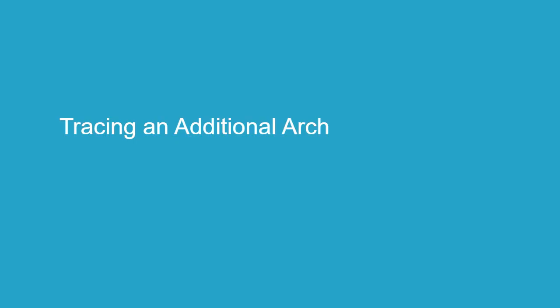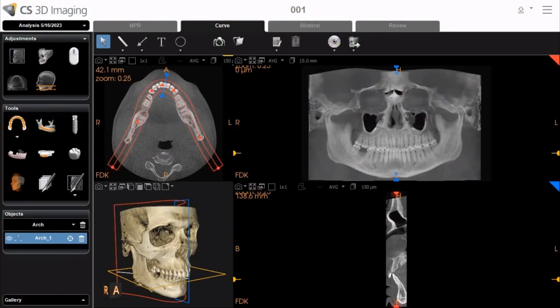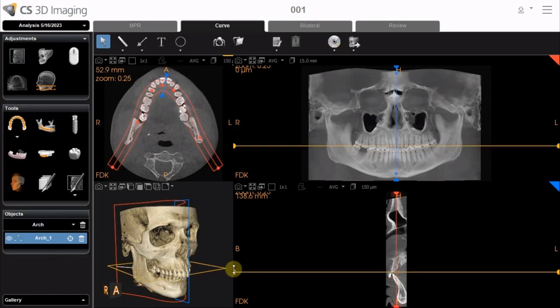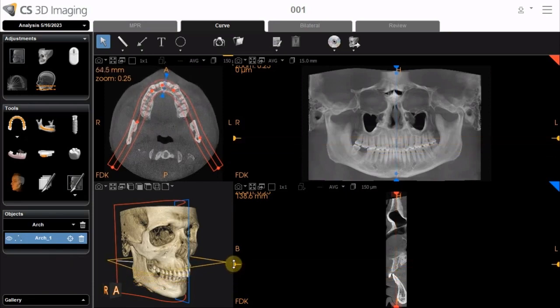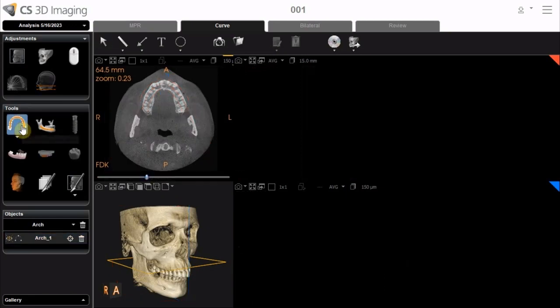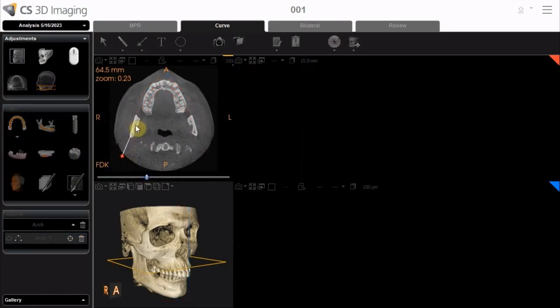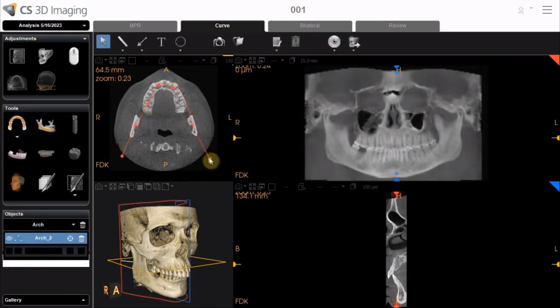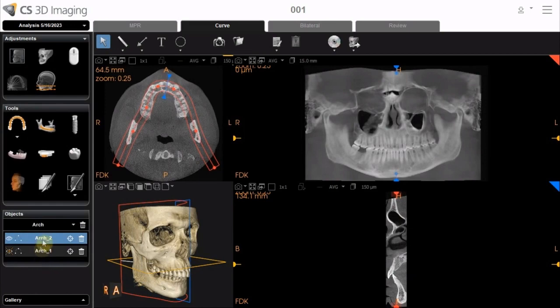Tracing an Additional Arch. The capability to trace two jaw arches is now available. As demonstrated, trace the first arch. In the Object List, double-click inside the toolbar to name it. Move the axial plane to the second arch position, activate the Manual Tracing tool, and trace the second arch. Then name it. The user can now easily toggle between the two arches.